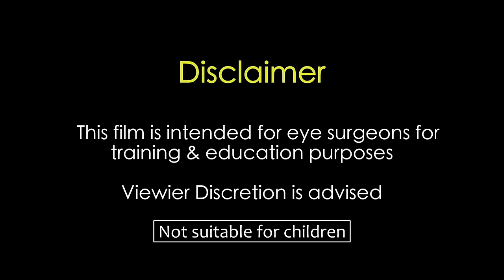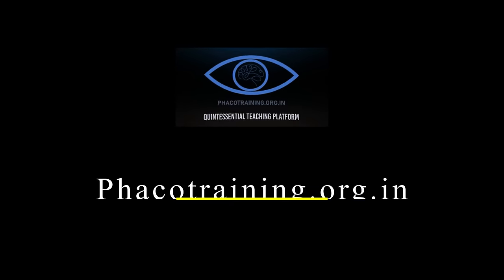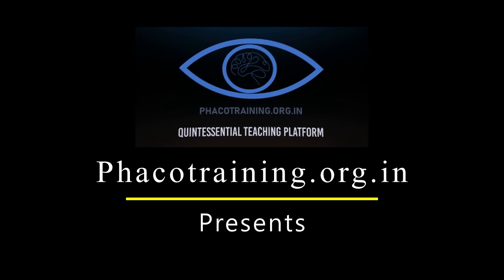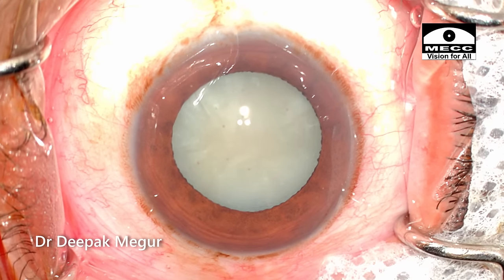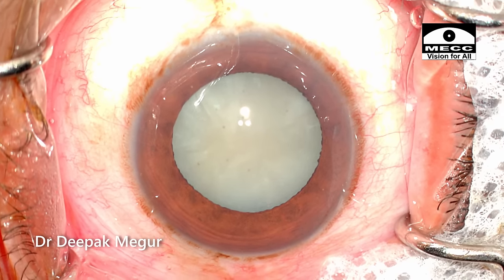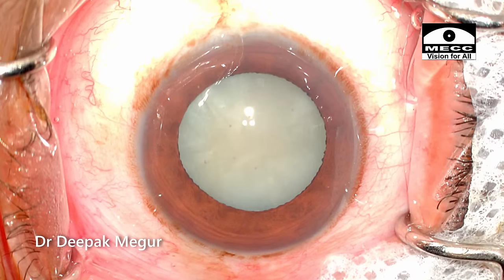This film is intended for eye surgeons for training and education purposes. Viewer discretion is strongly recommended. Hi, this is like a vlog and I'm going to take you through a routine case, mostly unedited. Let me know whether you like such unedited versions of the cases as well.